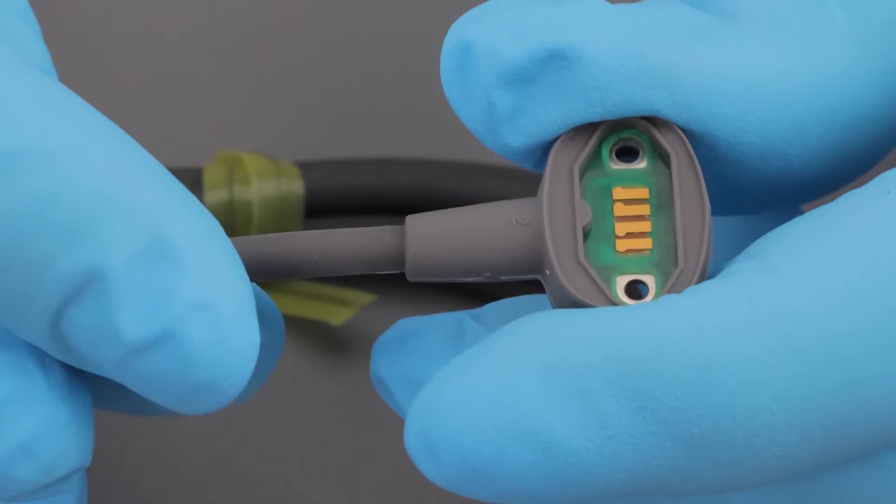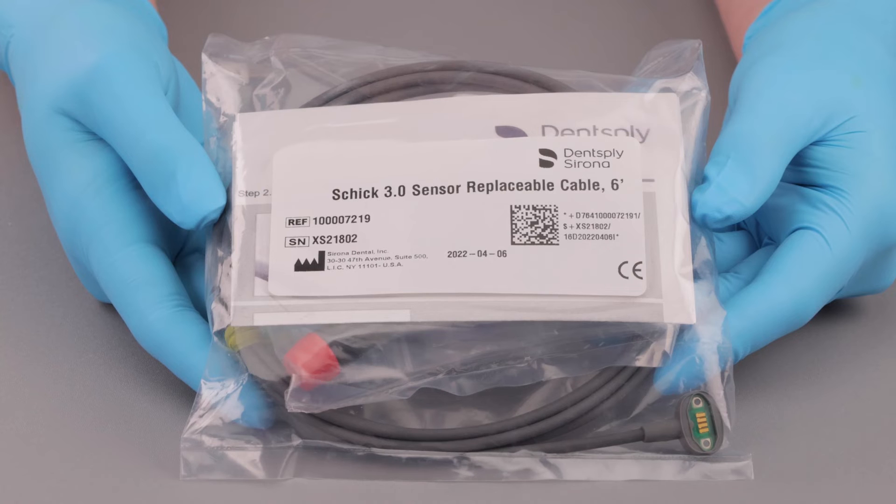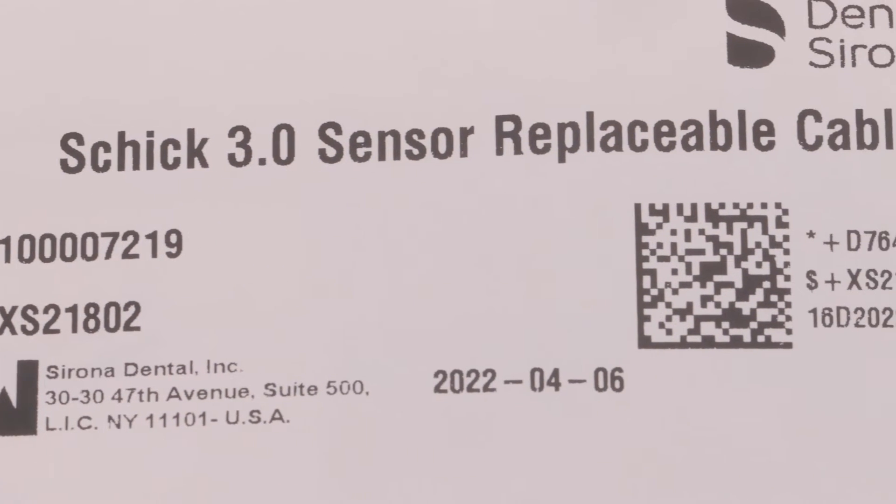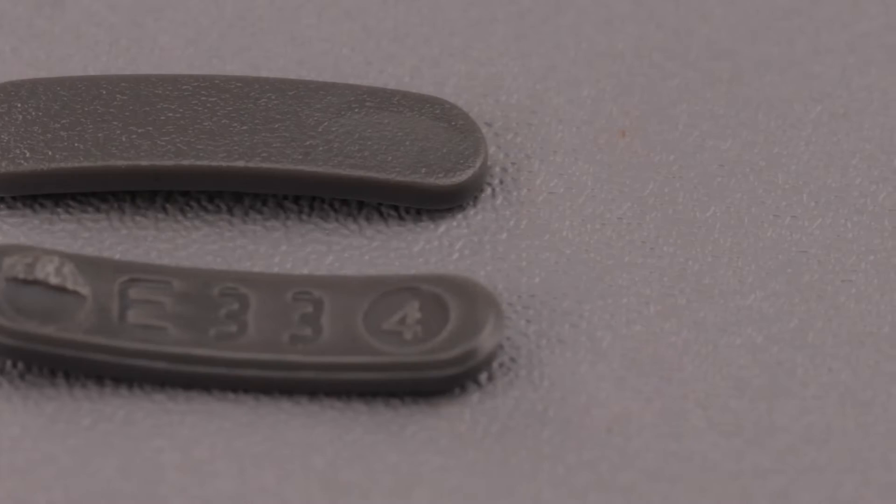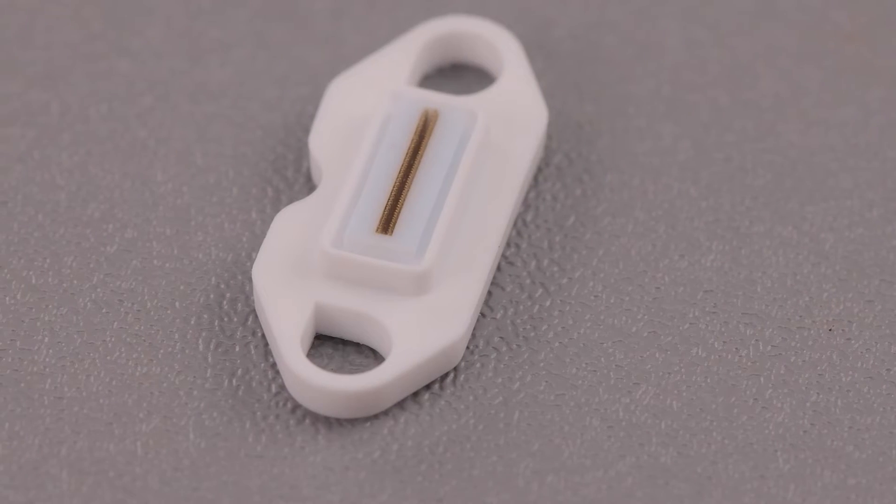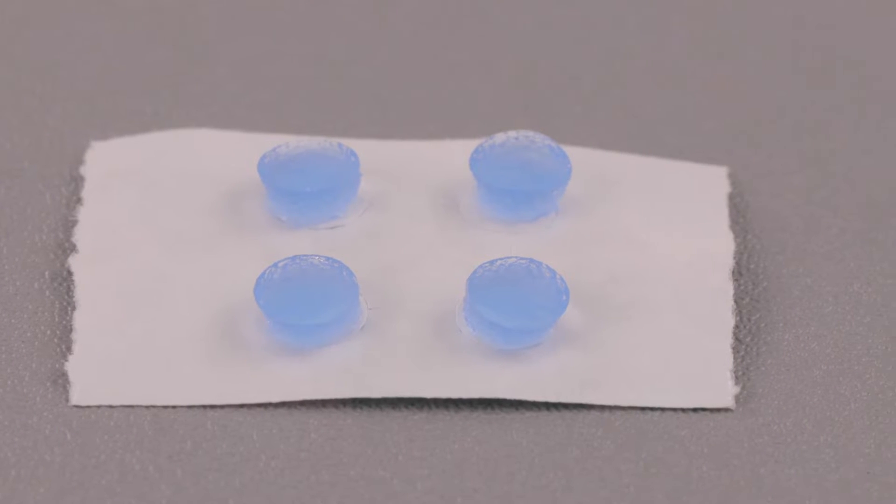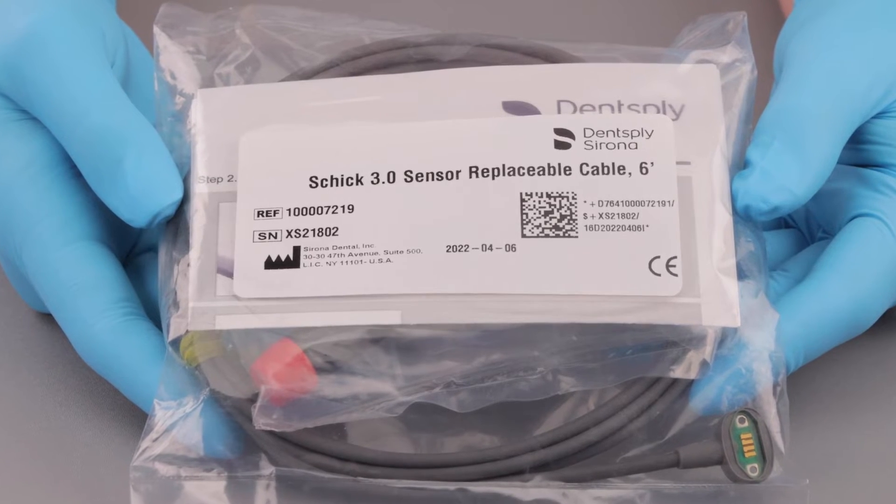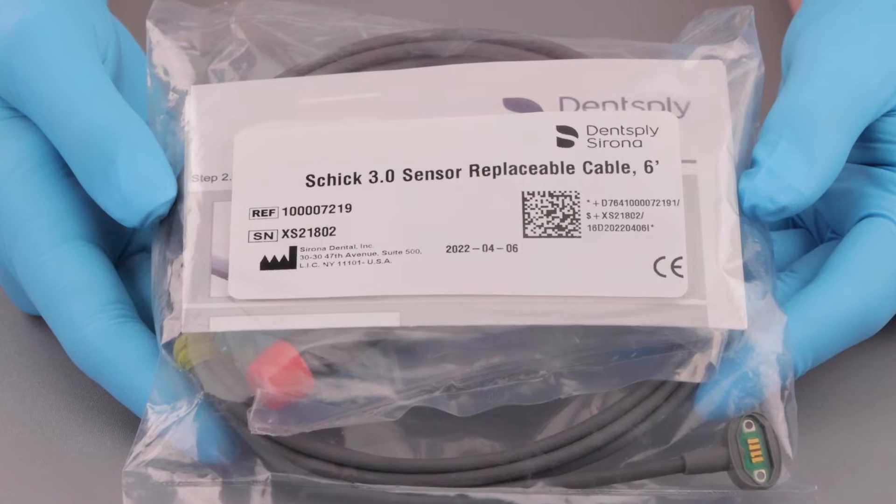Each Schick replacement cable kit includes all of the necessary components for the Schick 2.0 to 3.0 cable upgrade. These components include replacement screws, replacement covers, replacement elastomeric strips, replacement gel discs, and a replacement cable. There are extra replacement parts in each kit in case you misplace one during the cable exchange process.